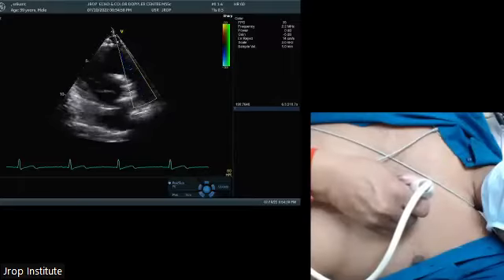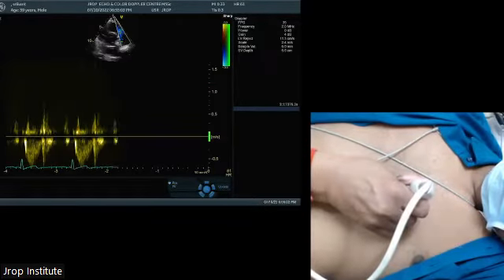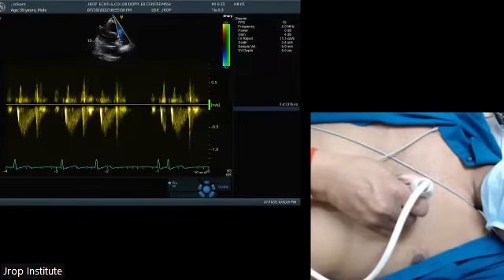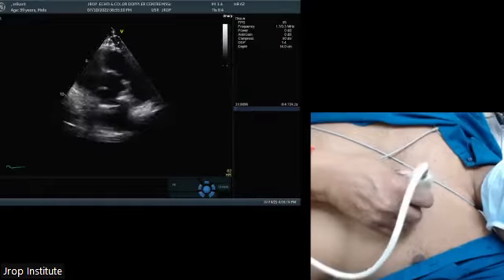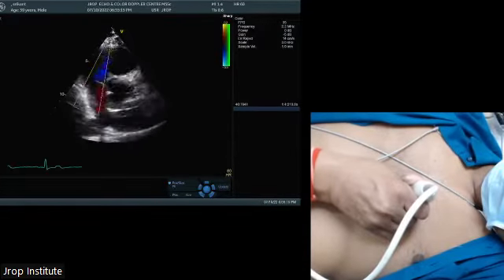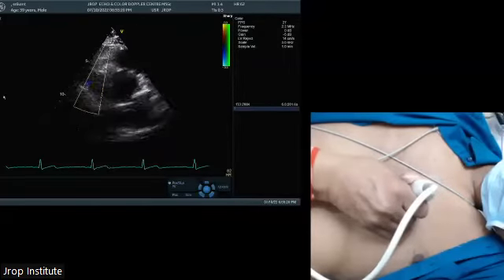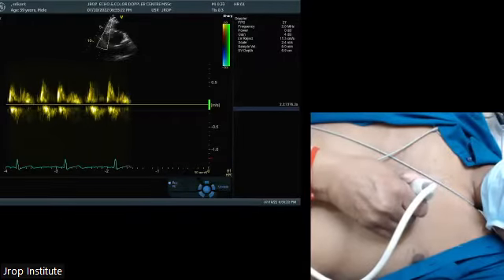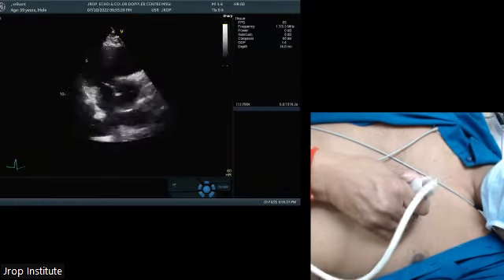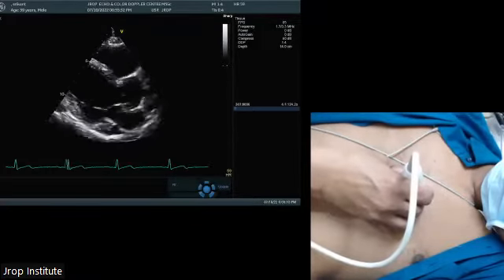So this is a place where we'll do parallel short axis view at aorta, we'll get a pulmonic flows. Now you can get good pulmonic views, pulmonic flow patterns. At the same time, I can get a short axis view at aorta, my tricuspid flow pattern, because I'm parallel to blood flow in tricuspid valve. Right? And no other flow would be seen in this window.